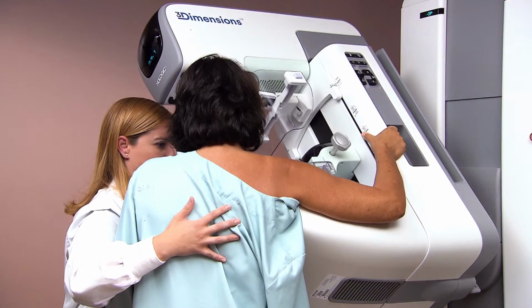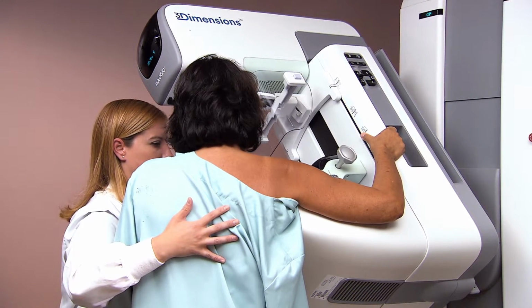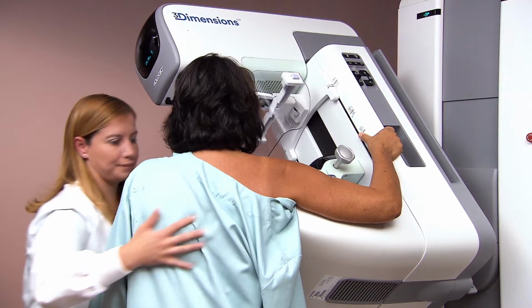One of the other drawbacks of 2D mammograms is that it creates false positive findings, meaning we're seeing things that are not really there. And for that reason, we've historically called a lot of patients back from their screening mammograms for findings that aren't truly within the breast or the anatomy. And 3D mammograms or tomosynthesis allow us to see things in greater detail and get rid of those false positive findings. So we're seeing an improvement in the callback rate for patients with screening mammograms.